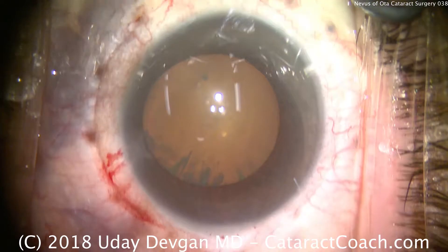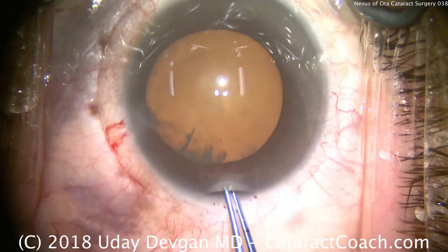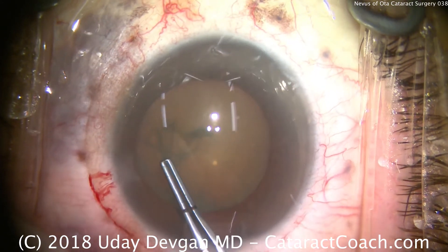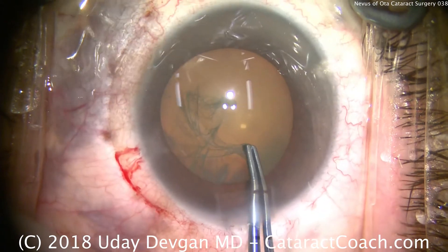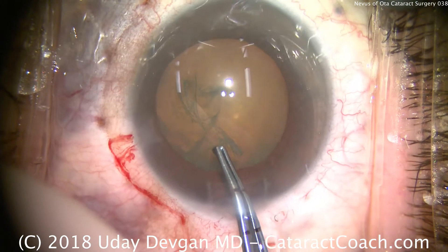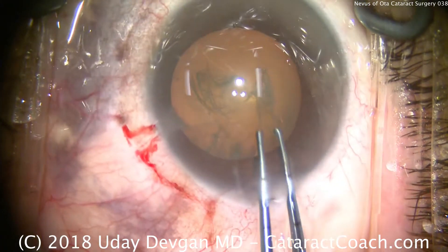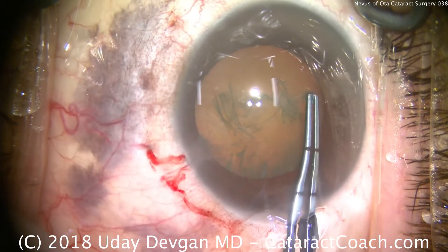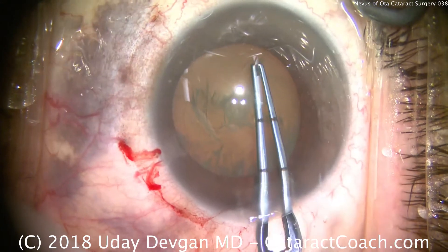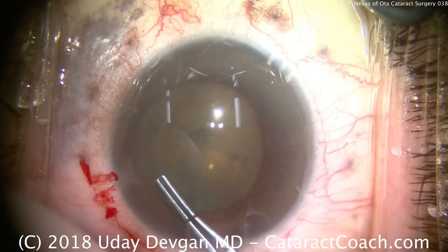We'll now make our capsulorrhexis. In doing this, my decades of experience over tens of thousands of surgeries have left me feeling that this is a very thin capsule. It feels different than the patient's first eye — the way that it tears, the way the tissue handles. Her first eye, of course, did not have the nevus of Ota, since that's a unilateral condition. So we'll take our time, make sure we get a nice, round capsulorrhexis — and that looks great.